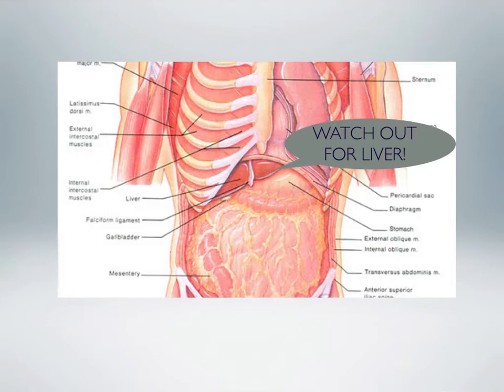So just looking at the anatomy here, you can see that if you go subxiphoid at a 45-degree angle, aiming towards the shoulder, one just about has to go through the area of the liver. But you're using a fairly thin needle, and if you recall, a person who has a liver biopsy has a very large core of the liver removed, and there are usually no untoward side effects. The bleeding will typically stop.